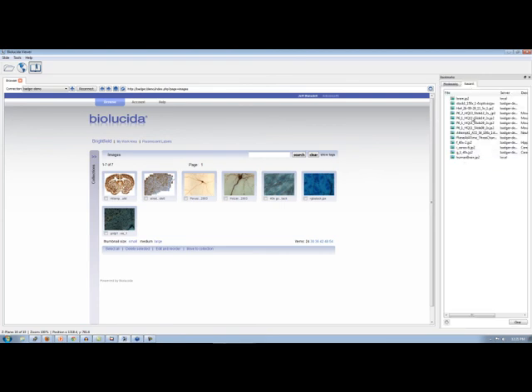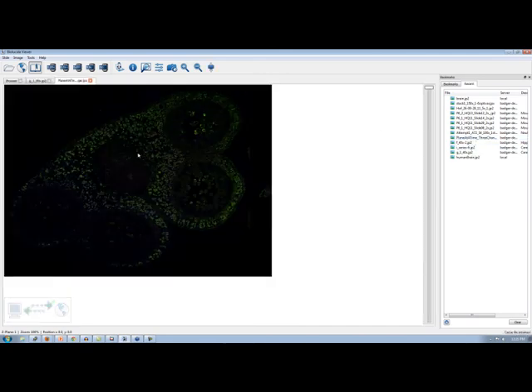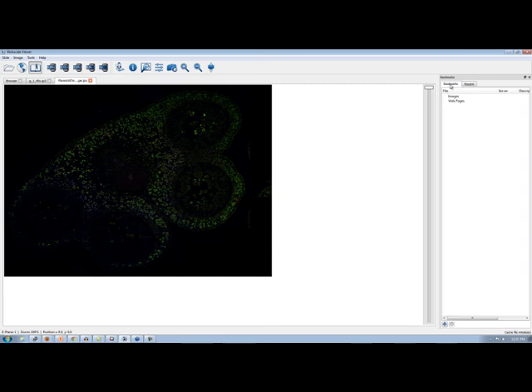The recent list here is a list of all images that you've opened up. So at any point in time, this list will be updated with new images as you open them. You can click on the image we had opened earlier, and it will automatically open that same image back up. And we can do that for all those. Now the other tab is, in my opinion, much more interesting, and that's the Bookmarks tab.